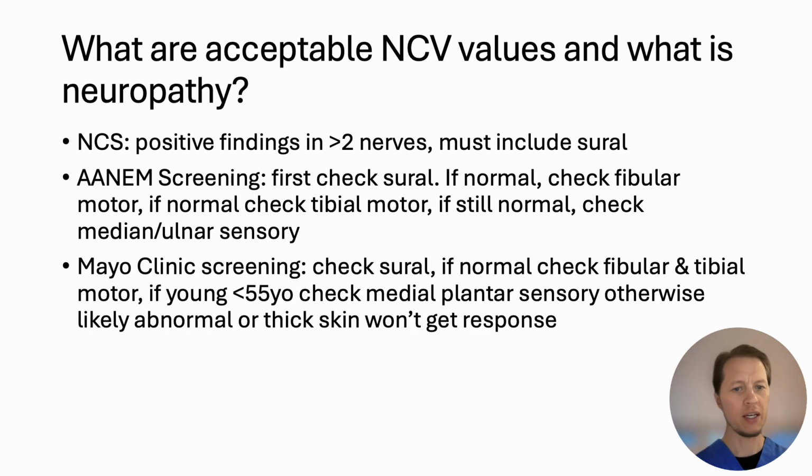If you go with Mayo Clinic, same thing. The Mayo Clinic. We have one out here near us in Phoenix, Rochester, Jacksonville. They're all over. Check surals, if they're normal, move on, same thing. If they're young and less than 55, you go to medial plantar sensory. Otherwise, it's probably going to be abnormal, or you have very thickened skin by that time and you won't even be able to get a response. That would be technically difficult.